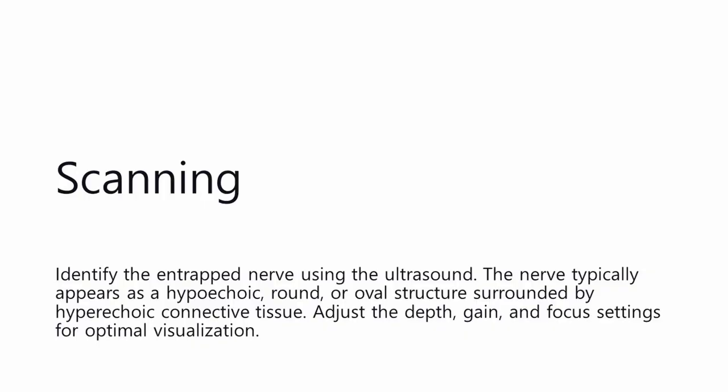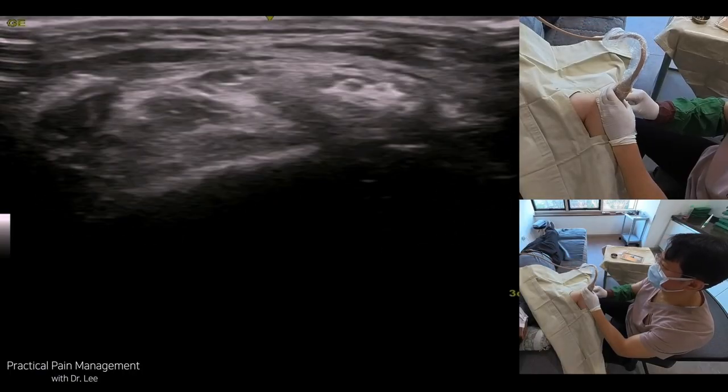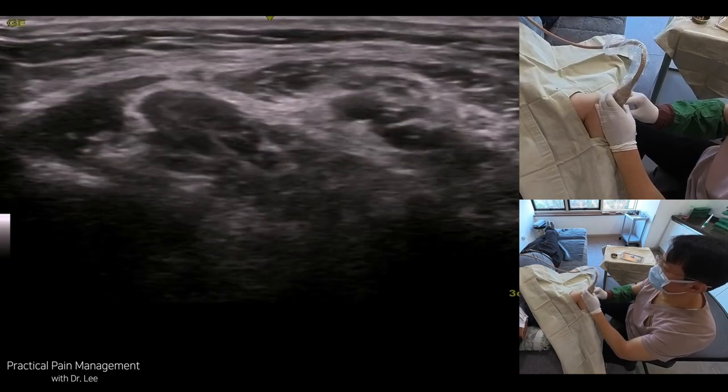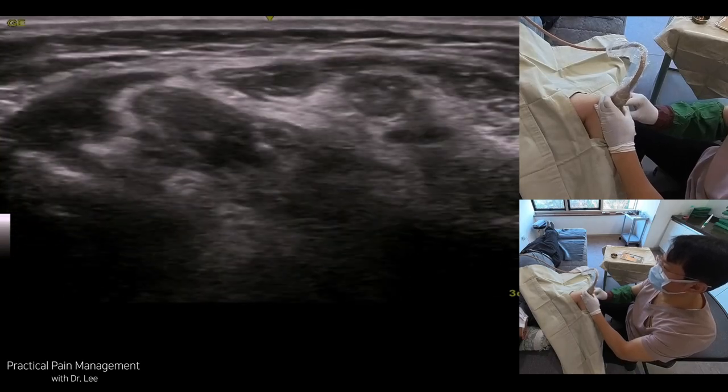Scanning: Identify the entrapped nerve using the ultrasound. The nerve typically appears as a hypoechoic, round, or oval structure surrounded by hyperechoic connective tissue. Adjust the depth, gain, and focus settings for optimal visualization.